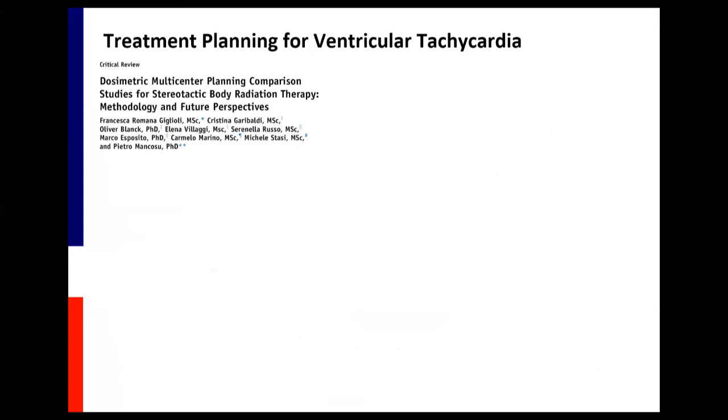This is some work. So we have looked at numerous treatment planning benchmarks. And really, we came to the same conclusion that every system today can treat everything. So there's some benefit of CyberKnife versus Linac-based or VMAT-based systems, but really in the end, they can all do the same if you have a good user using them.